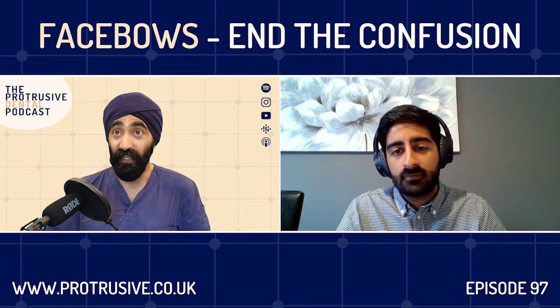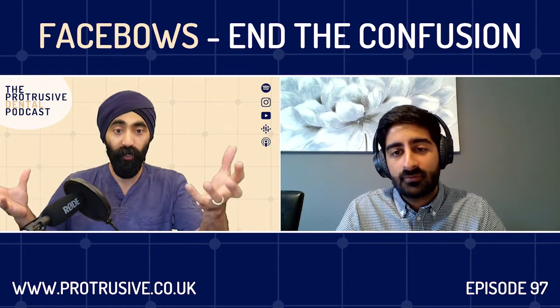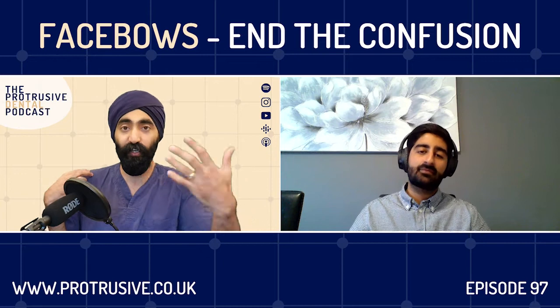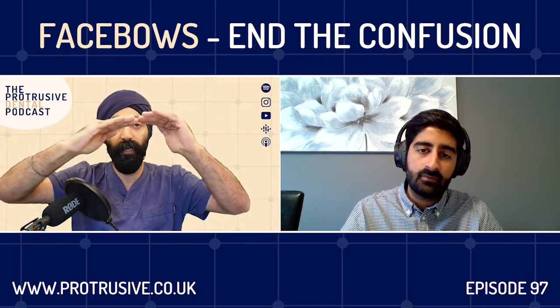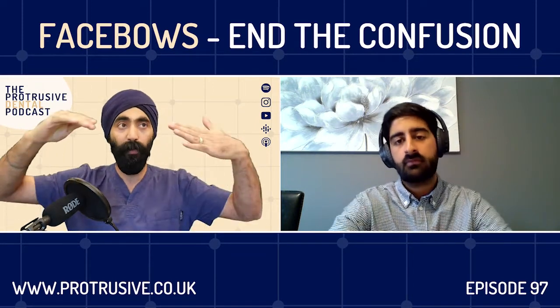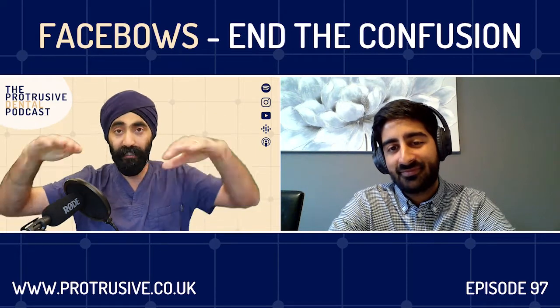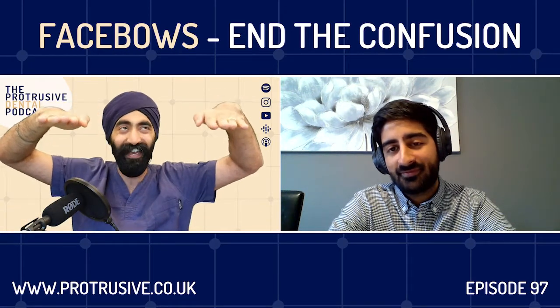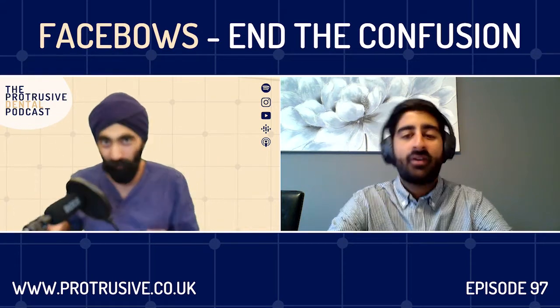It's an easy thing to do for all, and it's almost as though you're creating a wax jaw registration, wax rim, right? And you're able to draw on that. Now, the nuance is, obviously the putty is going to be a little bit curved. 3 to 3 will have that labial curve. Any tips on being able to draw a nice line? You're obviously looking at the eyes, assuming they've got normal eyes, and do you have a ruler, or are you doing it freehand? Any sort of tips or nuances?